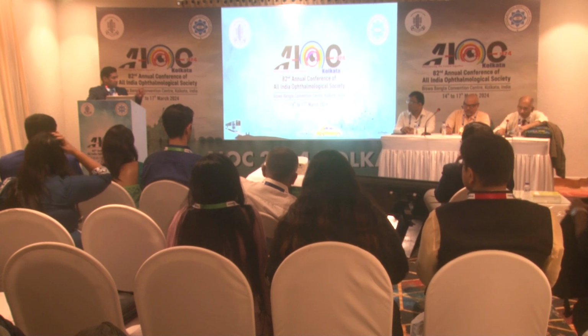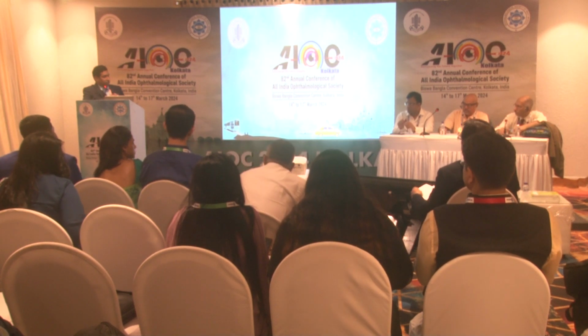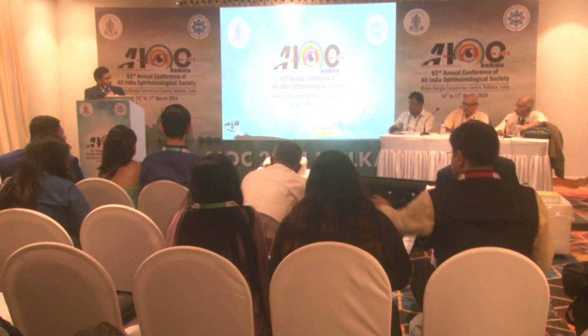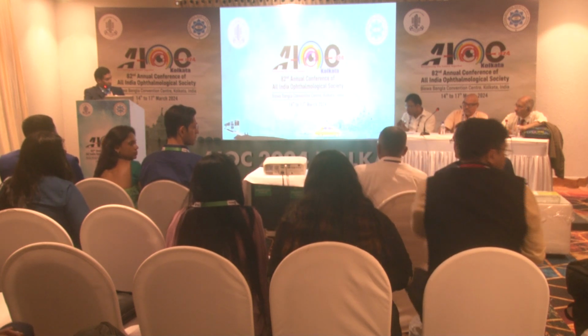You just cover that, so that you can roughly... and also, go on, finish. You can also do a post-operative ASOCT, as we have done in our cases, to confirm the presence of triamcinolone in the suprachoroidal space.